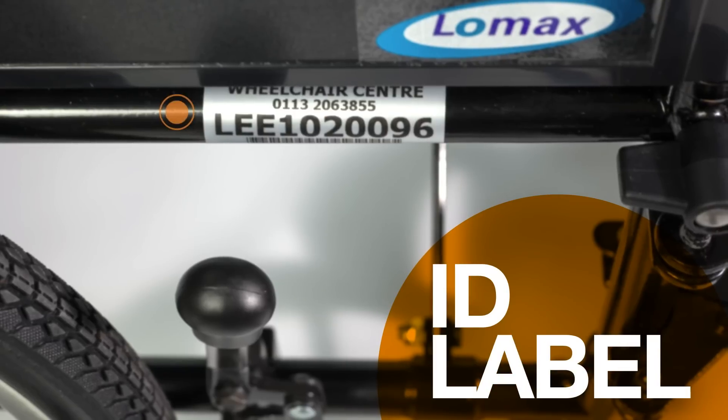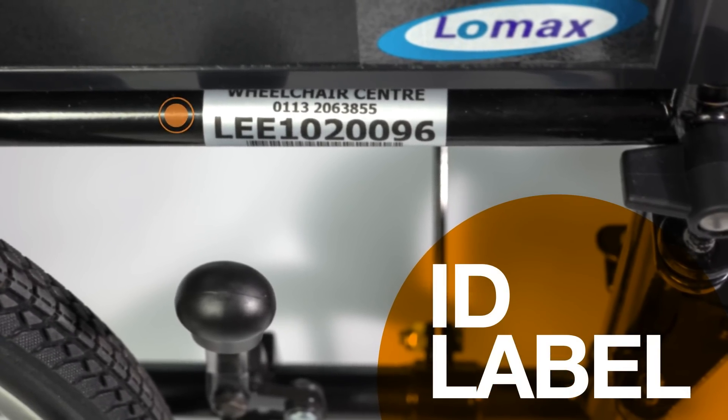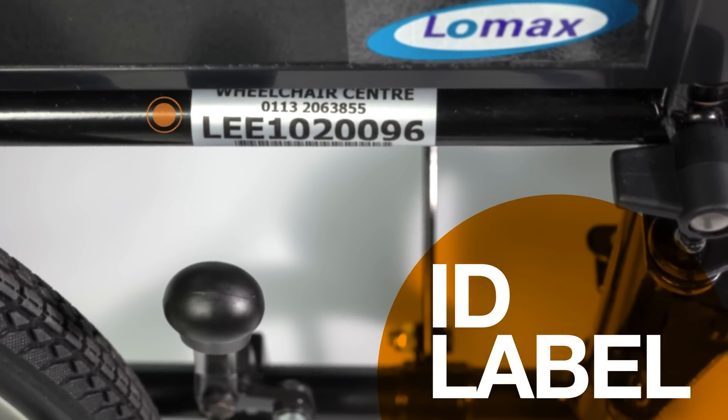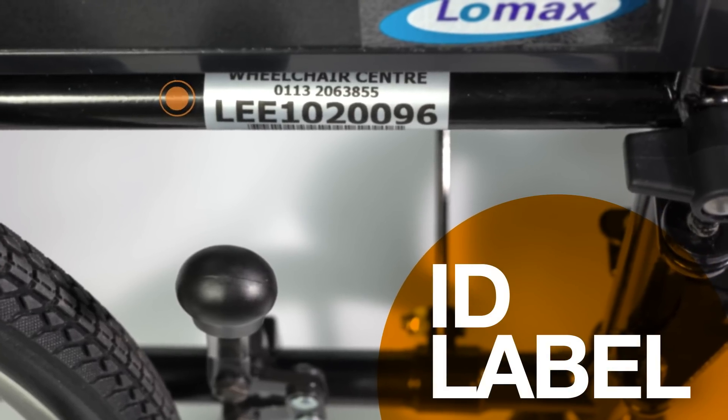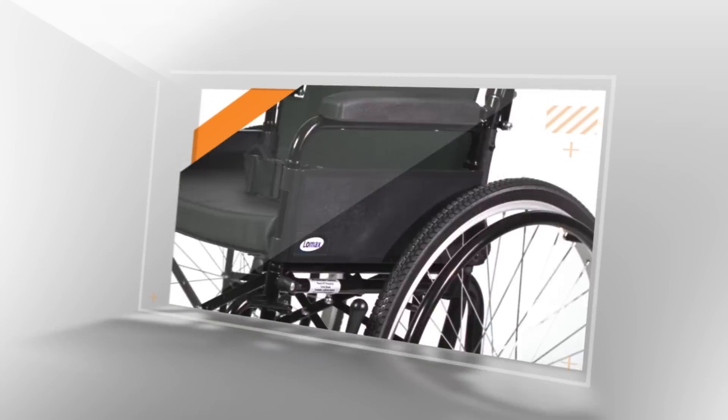Every wheelchair has a unique ID number printed on a label like this. Your service provider's contact details will be on here if you need to ask any questions. For advice and support on repairs and maintenance, please get in touch with your local wheelchair service.